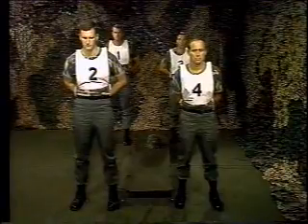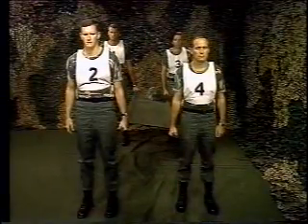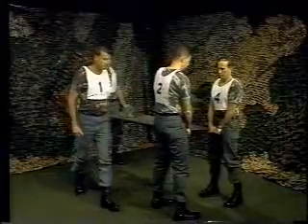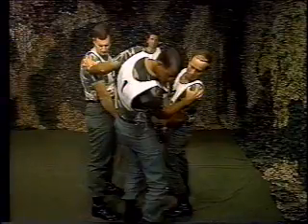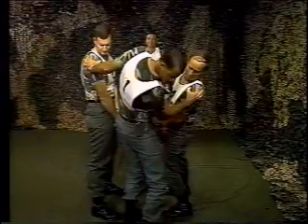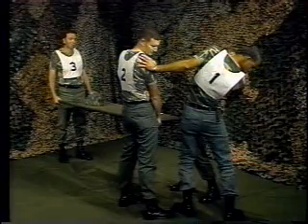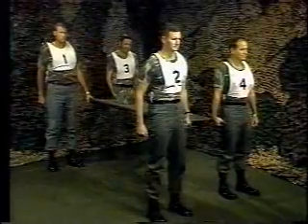Demonstration team, prepare to lift. Lift. Downhill carry, move. Got it. In this manner, as the team goes down the hill, they can possibly prevent the patient from falling. Once they reach the bottom of the hill, we give the command 4-person carry. Demonstration team, 4-person carry, move. Got it. Lower, litter. Recover.